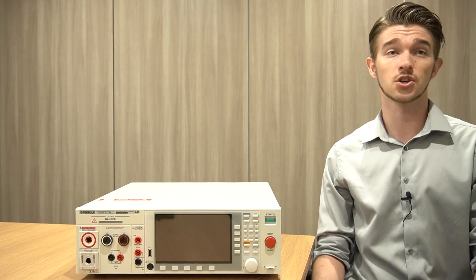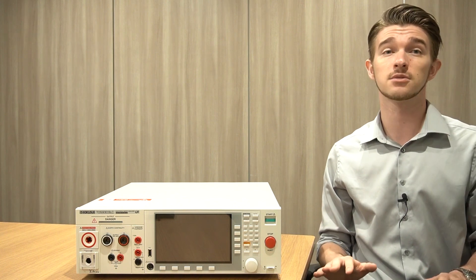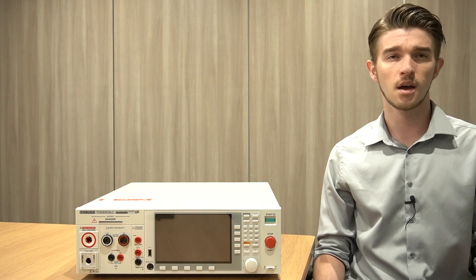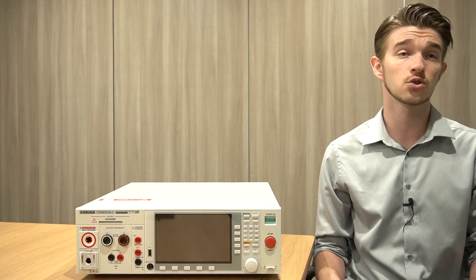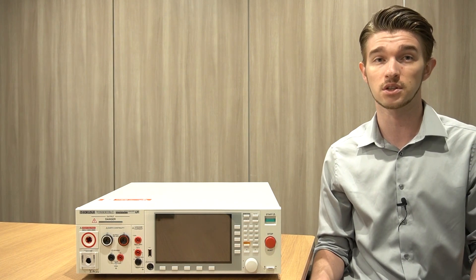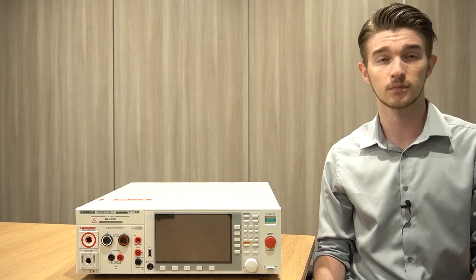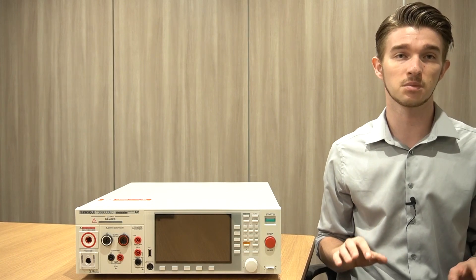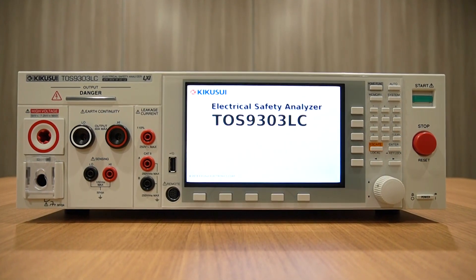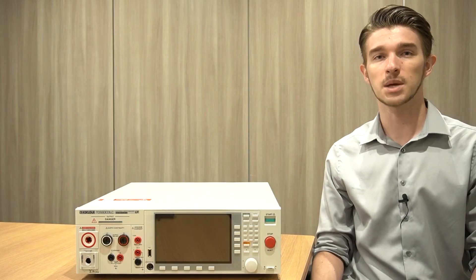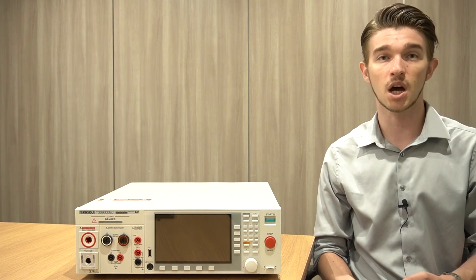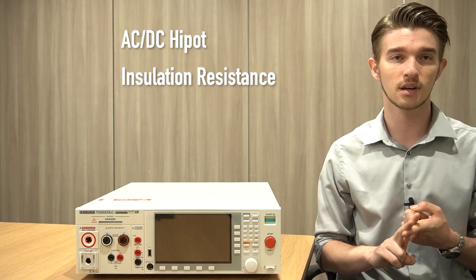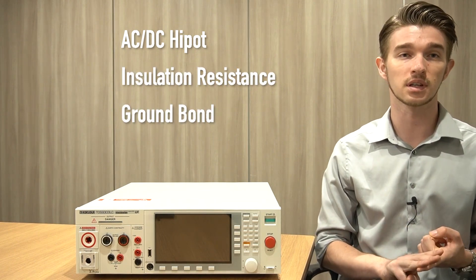The nature of patient leakage current tests requires cutting-edge measurement instruments capable of detecting extremely small traces of leakage current, as well as terminals that output 110 percent of the rated voltage of electro-medical equipment. Luckily, products such as the TOS 9300 safety analyzer series by Kikisu Electronics offer an all-in-one solution capable of not only patient leakage current tests, but come equipped with AC and DC high pot, insulation resistance, and ground bond testing capabilities in a single unit.